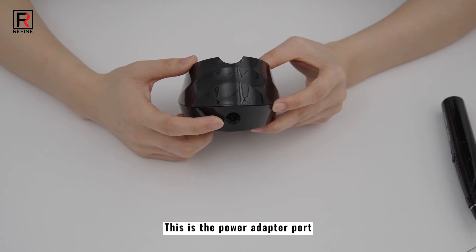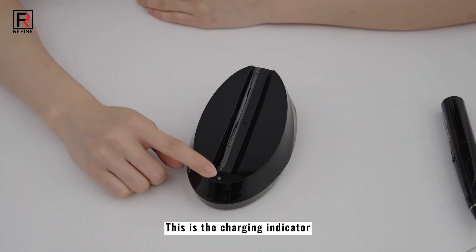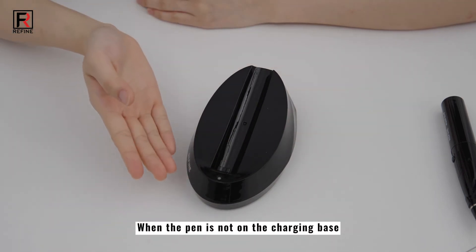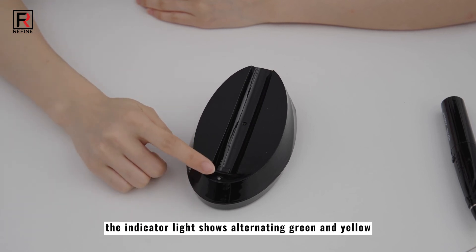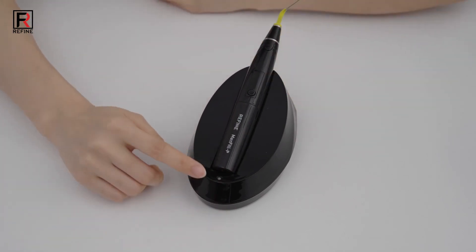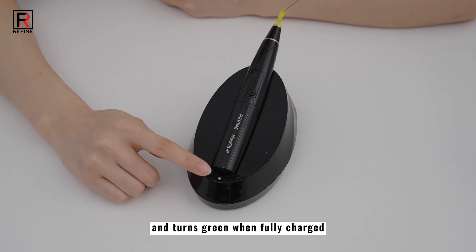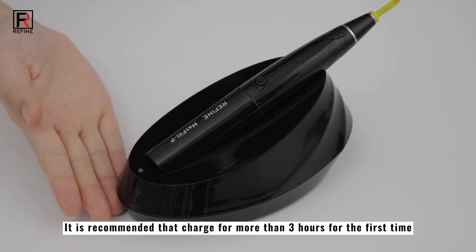This is the power adapter port. This is the charging indicator. When the pen is not on the charging base, the indicator light shows alternating green and yellow. The indicator light turns yellow when charging, and turns green when fully charged. It is recommended to charge for more than 3 hours for the first time to activate the battery and prolong the battery life.